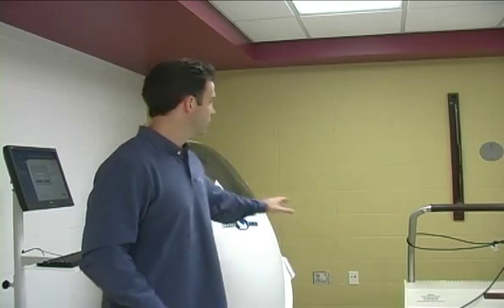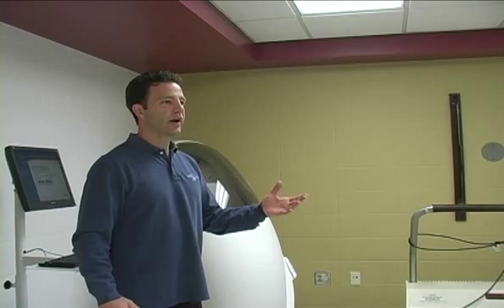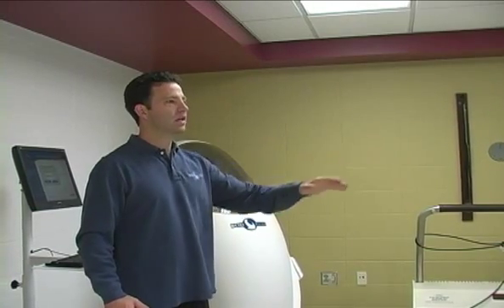Okay. And underwater weighing is great if it's an ideal situation because, as you know, Mary, the operator as well as the subject can influence the results. You'll see here later today, the operator, and I have confidence in Stacy, unless she does something, she just doesn't really read the directions because it's simplistic to operate, or maliciously, breaks protocol, she cannot influence the results. As well as Brittany. Unless Brittany breaks protocol, she really can't influence the results.